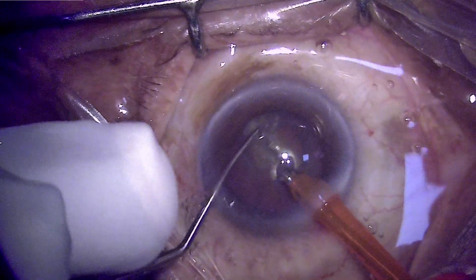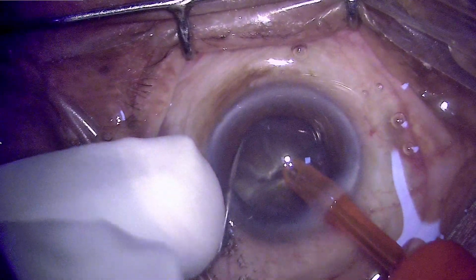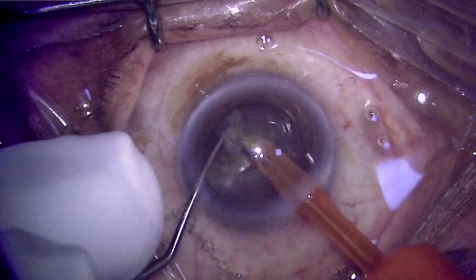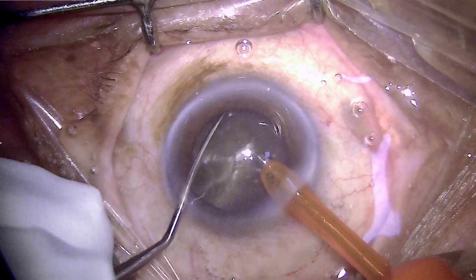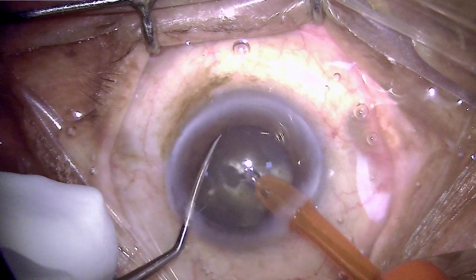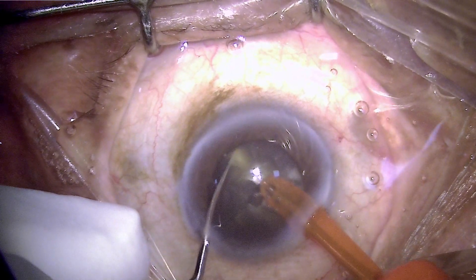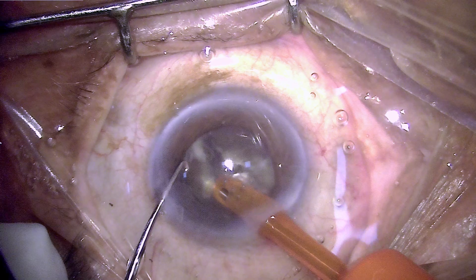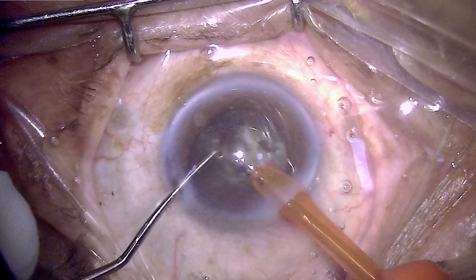I have found that instead of the total power used inside the eye, the proximity of the nucleus to the endothelium is the major factor which causes loss of endothelial cells and next-day keratitis. Once we have done the primary chop, we can ramp up the illumination — which was kept low so that the patient didn't have glare — and we have chopped the pieces using horizontal chop technique into four quadrants. Watch as I remove each quadrant and further chop it; this is one of the key factors.